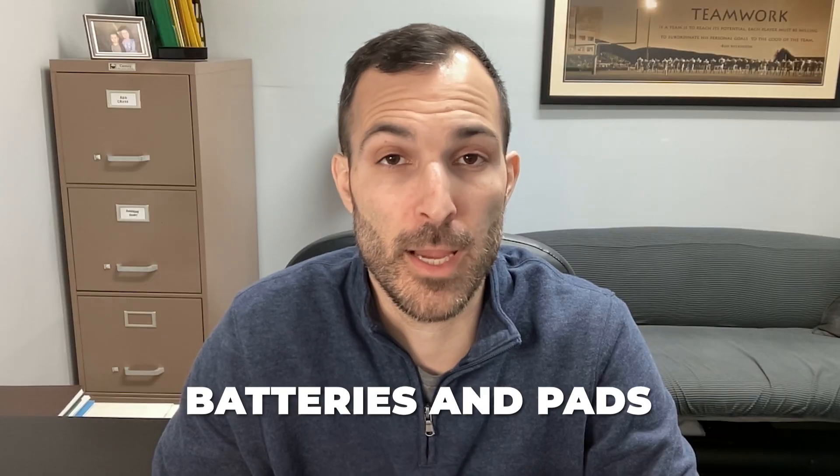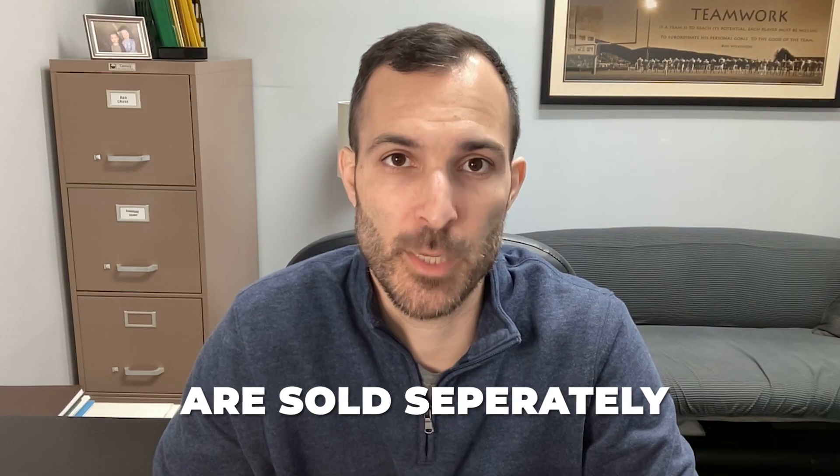That red light is indicating that there is an issue with the battery, and the pads are likely expired as well. This type of device is different in that batteries and pads are both sold separately. So if you have a device like that, you want to make sure you're checking not just the battery for expiration date, but the pads as well — because you might have to replace just the pads while your battery is good for another year or two.